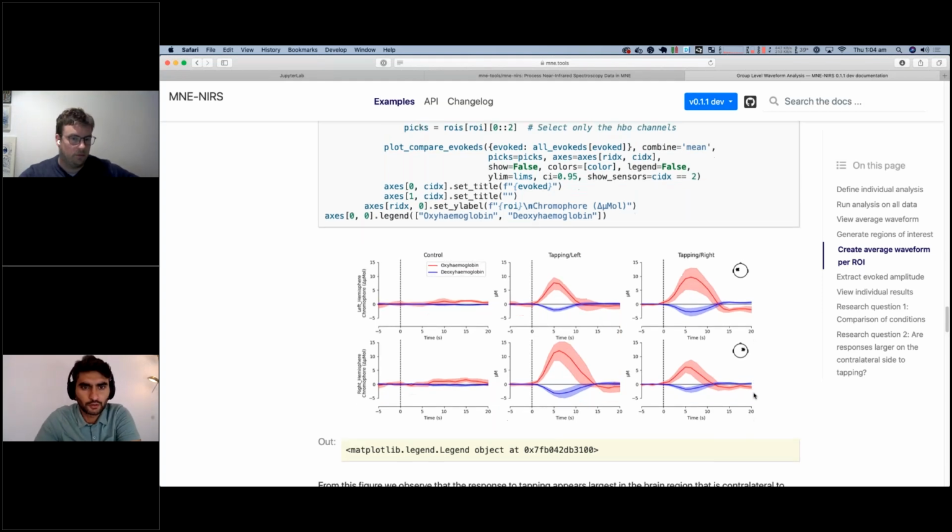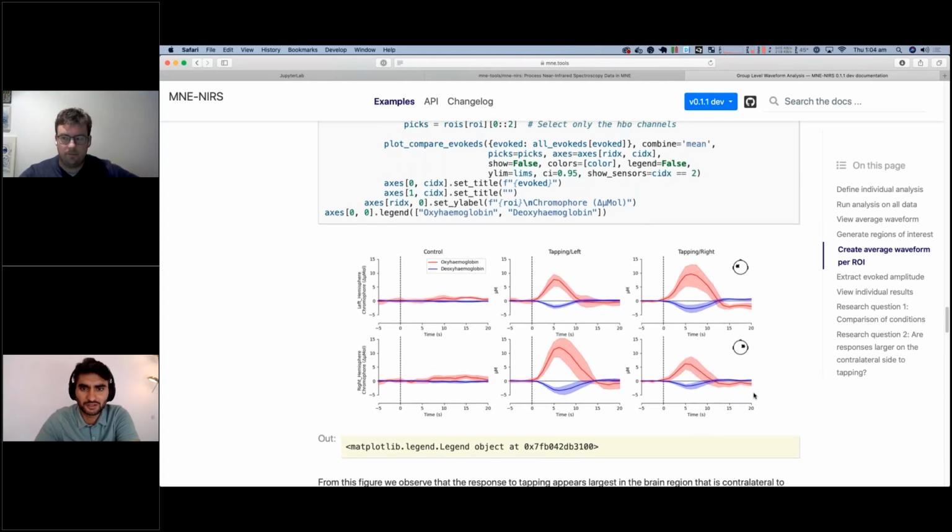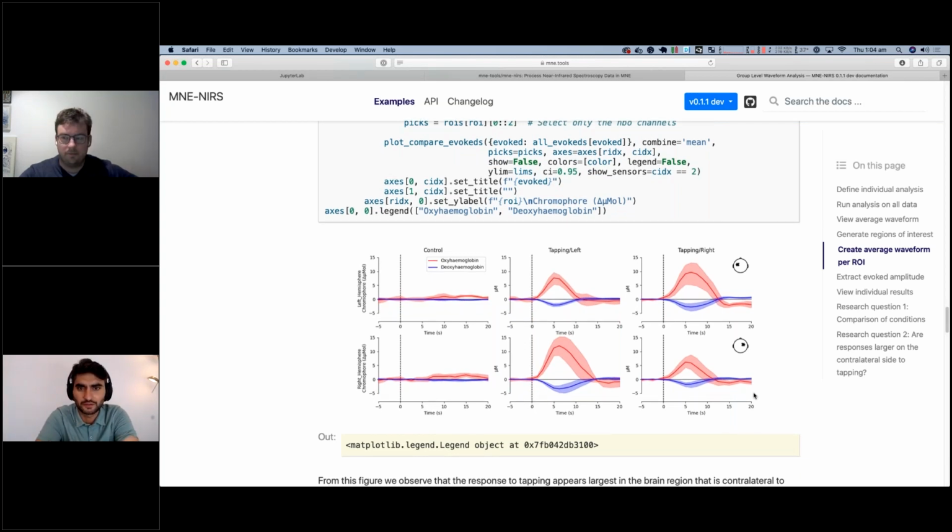This was also covered by you in the last talk, so if you could also give us a brief revision of it. Any hints on visualizing each step of the processing chain to see effects of parameter changes on output?